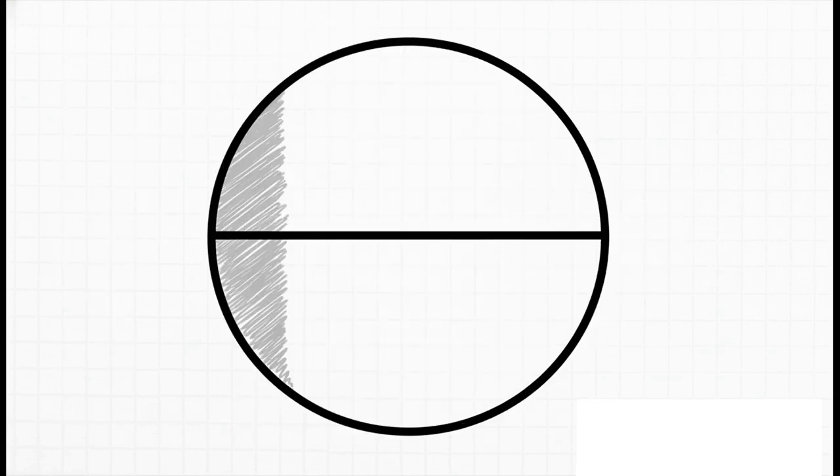Another huge early warning sign for glaucoma is something called a nasal step. It's a sharp, step-like drop-off in vision that perfectly respects the horizontal midline, but only in the nasal part of your field. Again, this isn't random. This specific pattern points directly to the kind of damage that glaucoma causes.